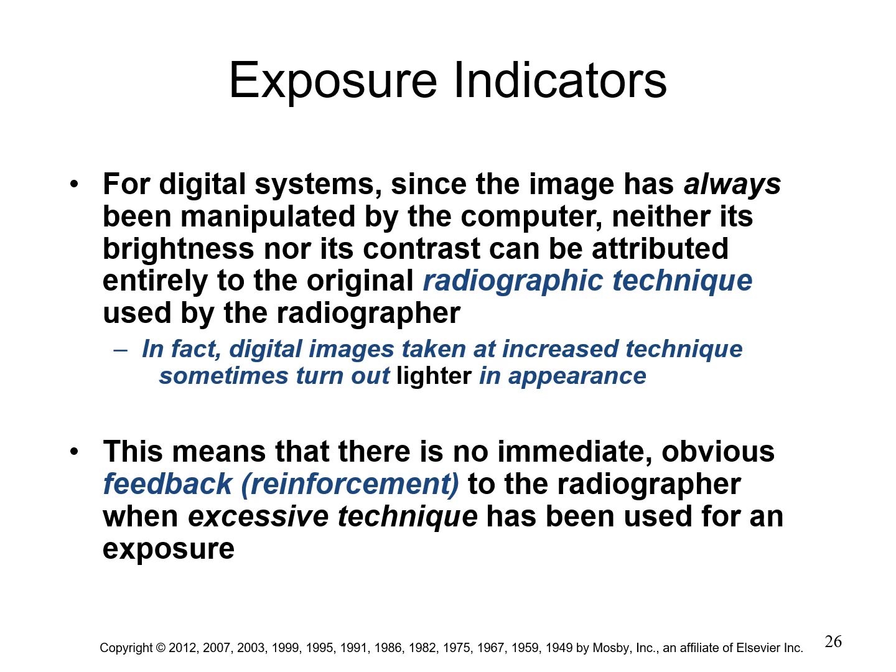Okay? So, what about overexposure? Well, your software can actually rescale all your pixel intensities. Let's say it's expecting numbers between 50 and 100 photons per pixel, but you sent it 150 to 300 photons per pixel. Well, it's not expecting that.